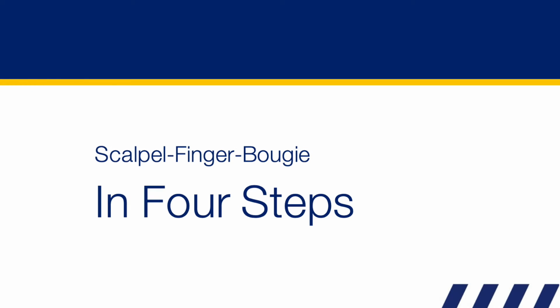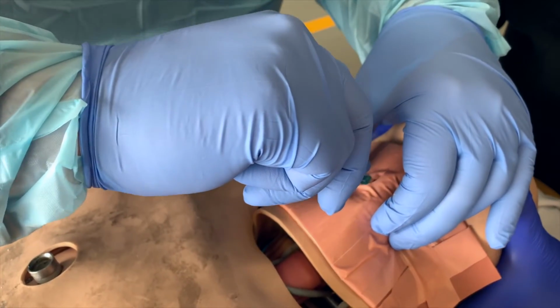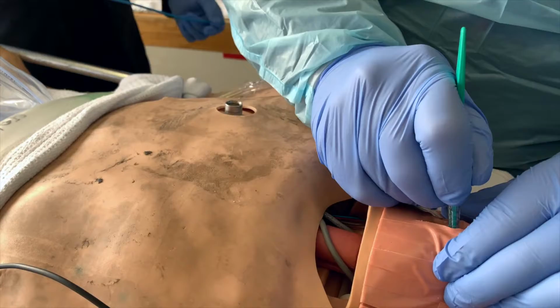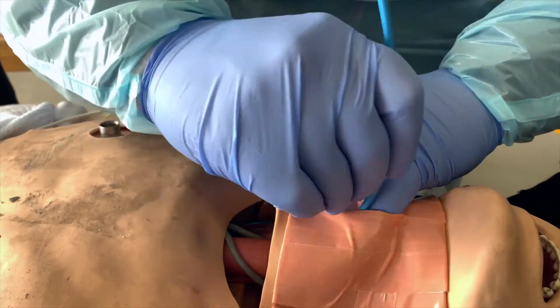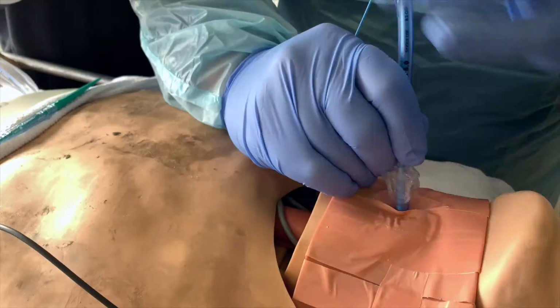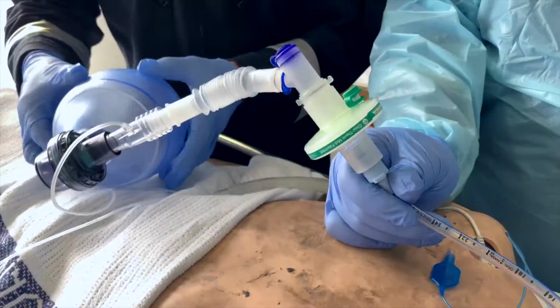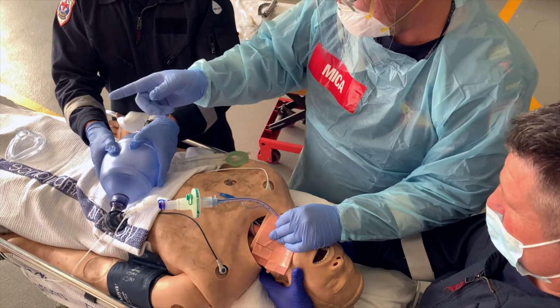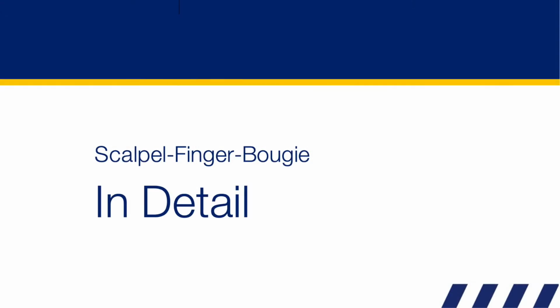To aid recall, the scalpel finger bougie procedure can be broken down into 4 well-defined steps. Step 1. Identify the cricothyroid membrane landmarks, perform the incision, and cut to air. Step 2. Dilate the membrane with your little finger and guide the bougie insertion down the trachea. Step 3. Railroad the ETT and inflate the cuff. Step 4. Commence ventilation, confirm placement by capnography waveform, and secure the ETT. Let's go through the procedure in more detail.